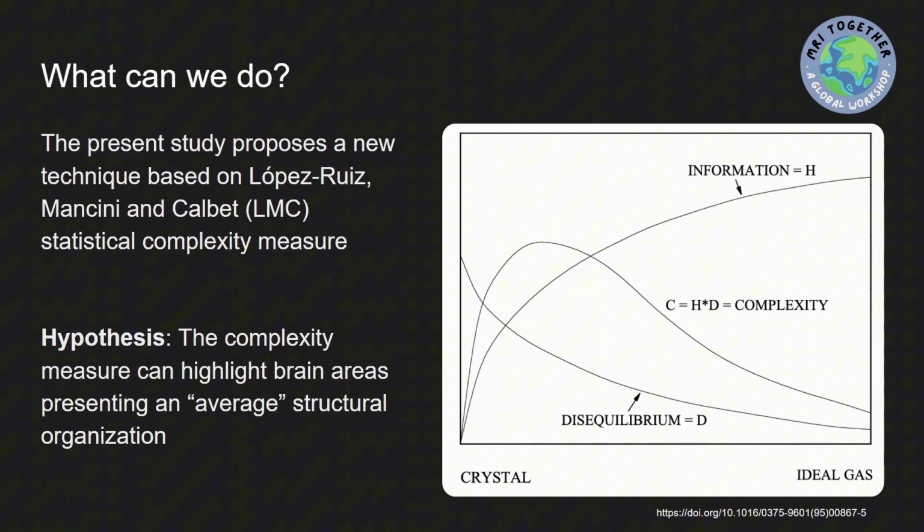So what we can do is give more emphasis or more focus on areas that are naturally lower signal for the classical DTI maps.